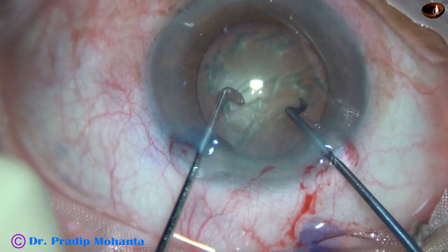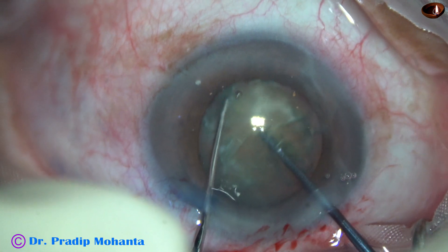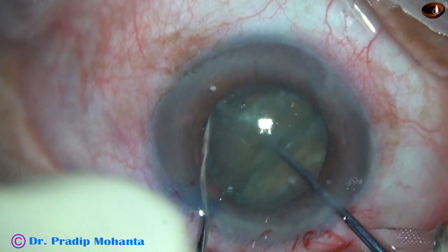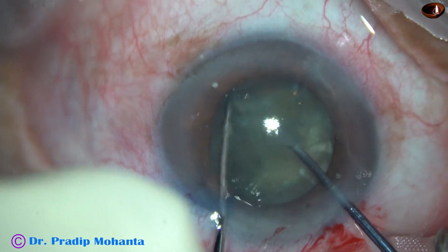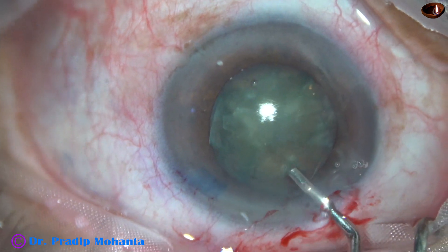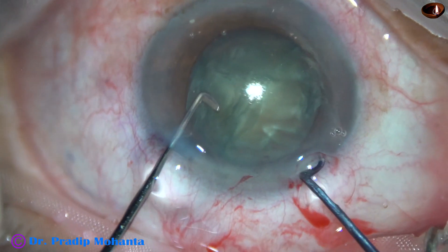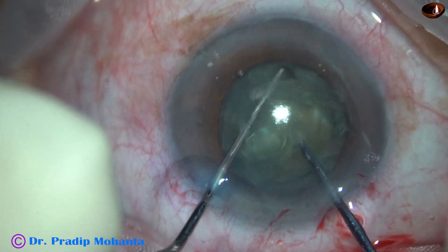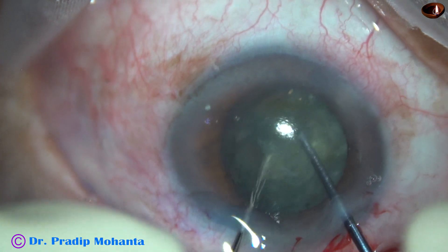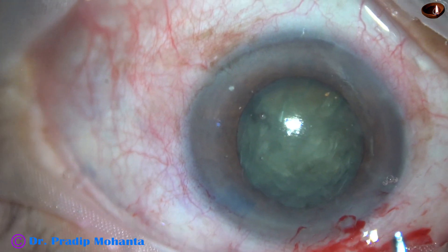Now watch this. This is dividing the nucleus with the pre-chopper. The two instruments come toward each other, and we should take care of the rhexis margin. I could not fully divide this heminucleus at first, tried again, but eventually we have two heminuclei. I inject viscoelastic, then rotate the lens mass and hook the equator. I could divide the nucleus nicely into three pieces — one heminucleus and the other heminucleus divided into two smaller pieces.